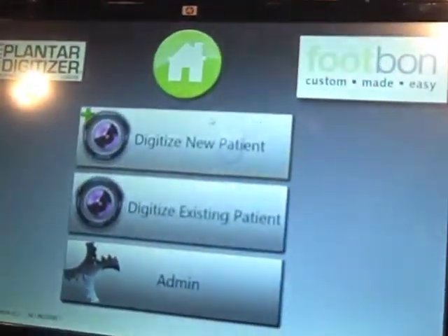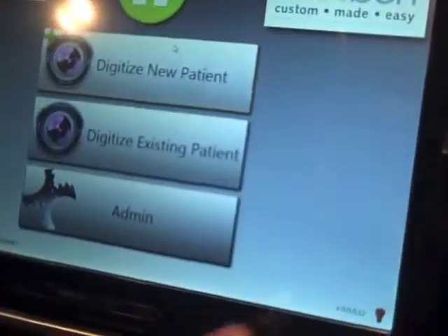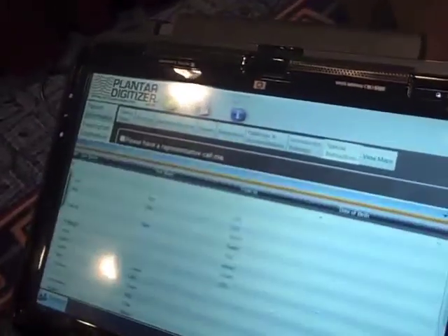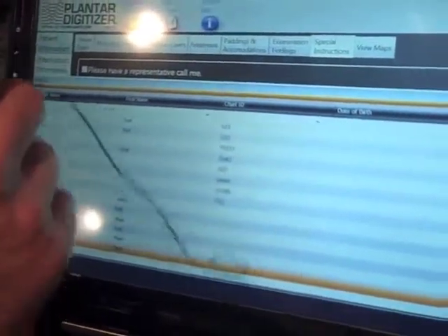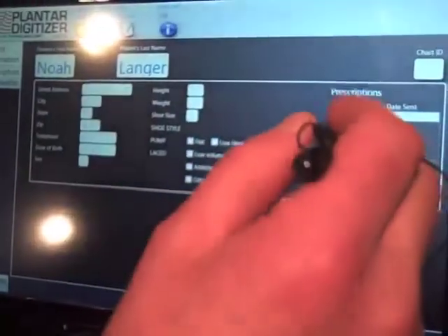Now I can see that my target is on the foot, so we know that we've got a good image. I can accept that. And then I bring up our patients — this is the patient I just digitized — and I select their digital map from today and edit that.